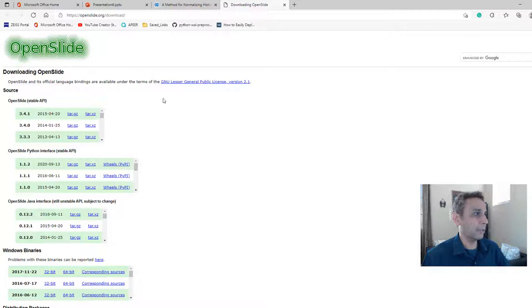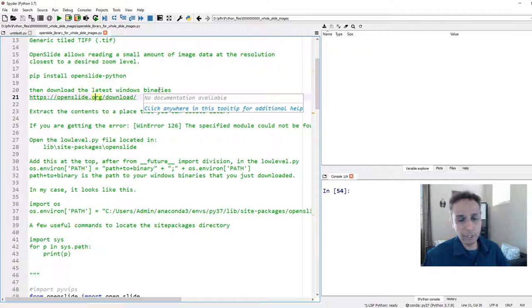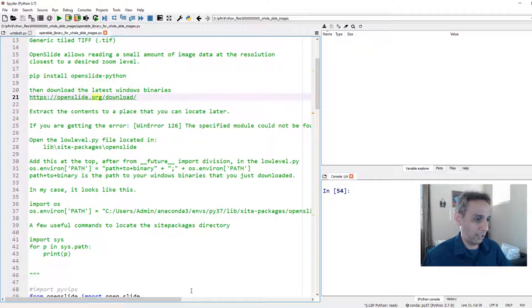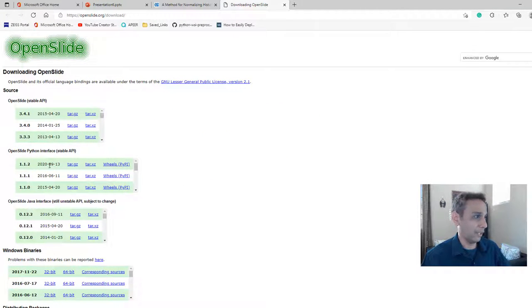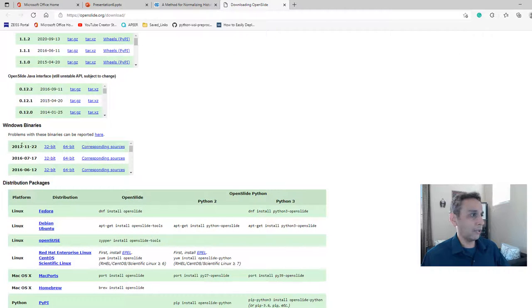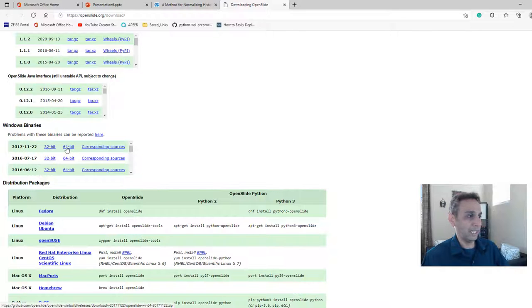Step two: go to that link and download the latest Windows binaries. We're working on Windows, so download the 64-bit version. If you're on Mac, find the appropriate one. Go ahead and download the latest Windows binary — I downloaded the 64-bit one.